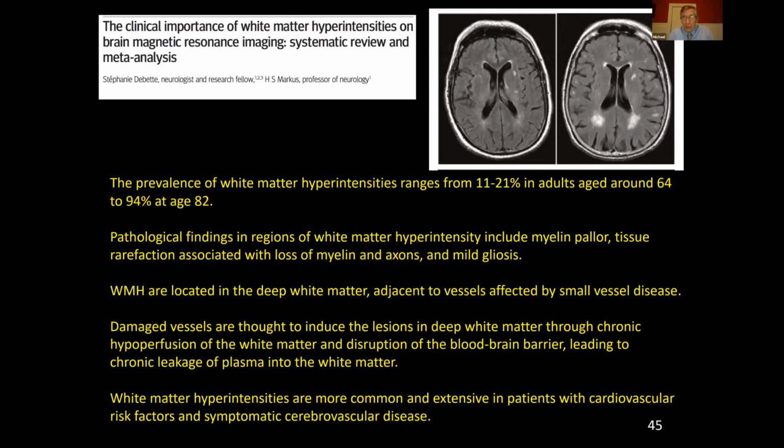There's been a fair amount of literature on white matter hyperintensity burden, in that people in their 50s and 60s who have more white matter hyperintensities, and we're seeing up on these MRI images these big white splotches, that's what we call the white matter hyperintensity. Those are thought to be a harbinger of dementia or Alzheimer's that may be arising several years down the road.